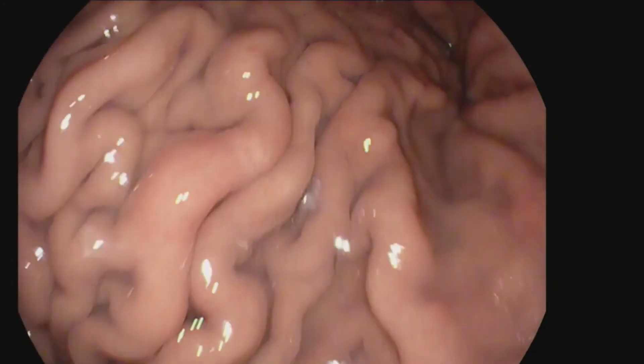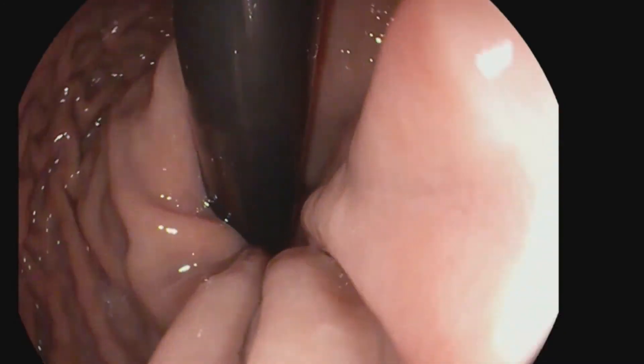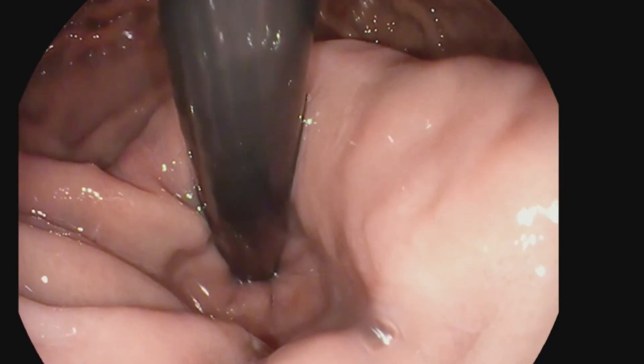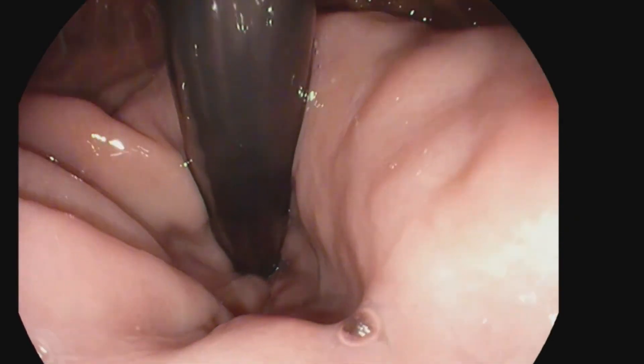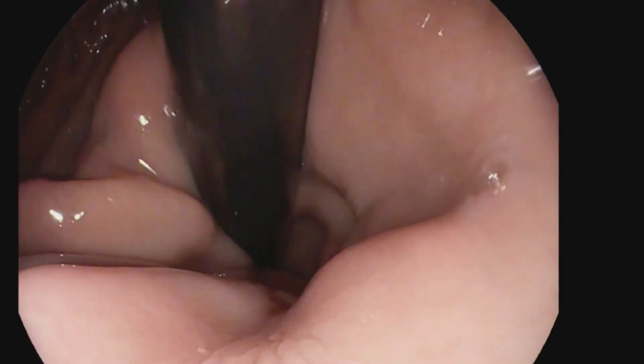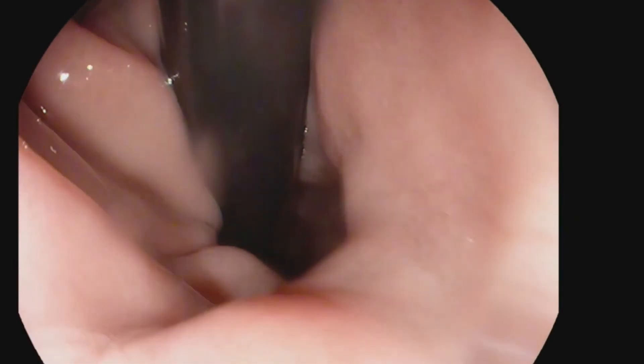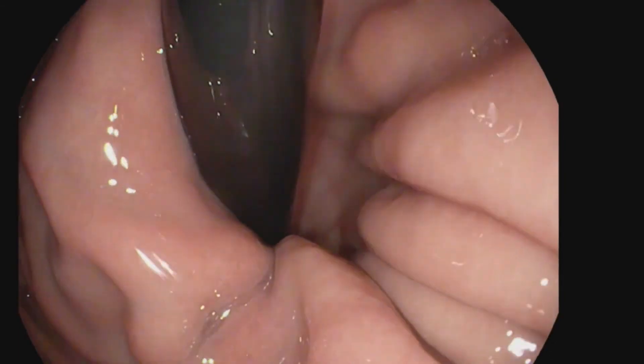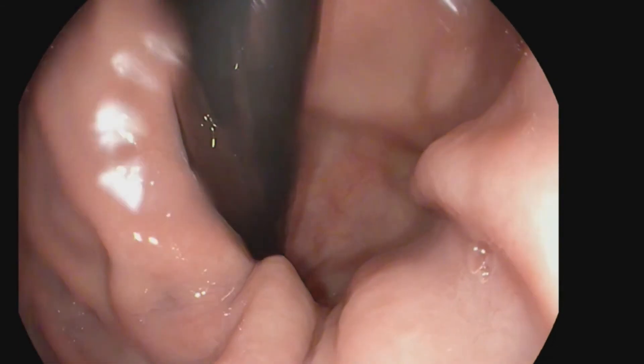For a Hill-grade 3, we can see that once we are fully insufflated, the hiatus maintains a gap off of the scope and never grips the scope for any significant period of time. The mouth of the hiatus often widens with inspiration but never fully closes.